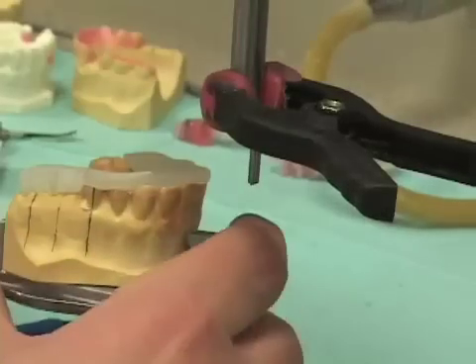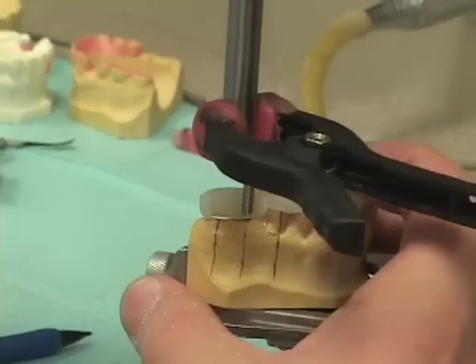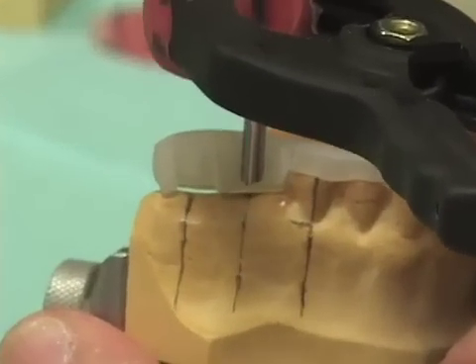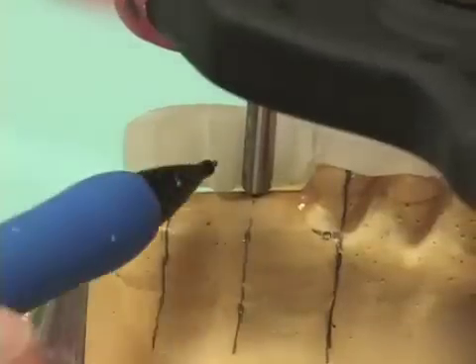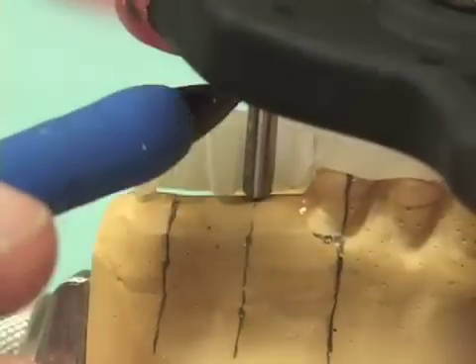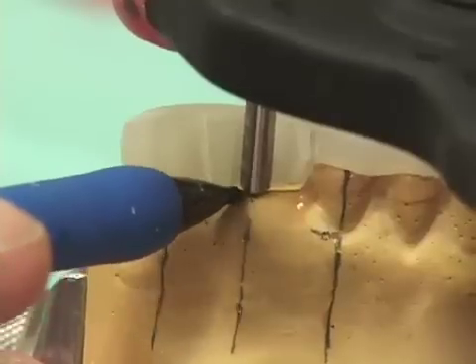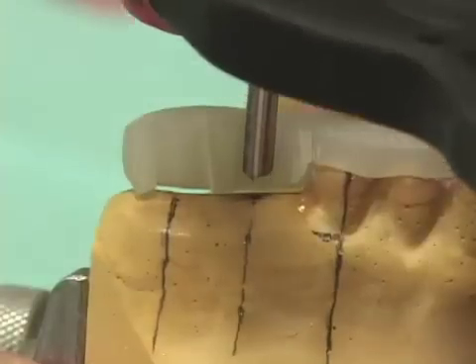Now, just like we had done before, we place the drill blank — and here again we have to be very particular and get a good look. It's hard to see with this clamp in the way, but I'm being very particular in making sure that my drill blank is positioned exactly over the spot that we had indicated for the placement of our implant.